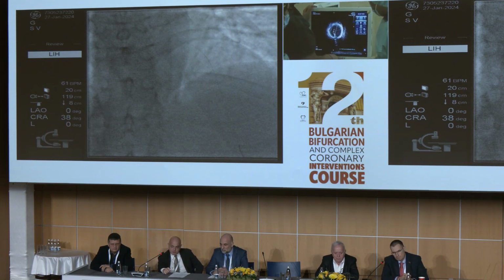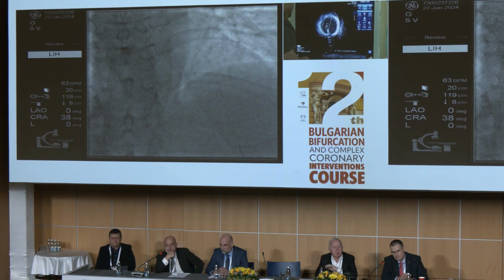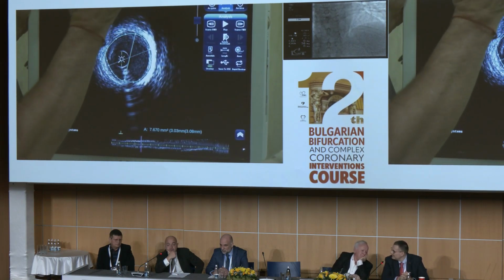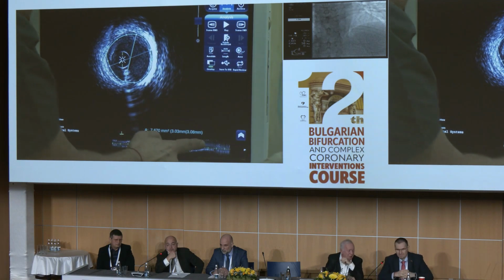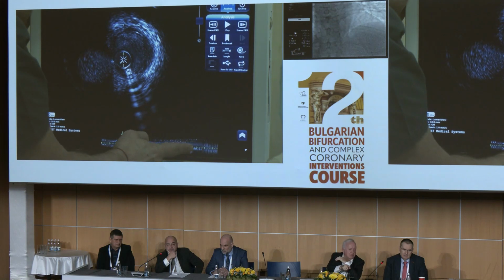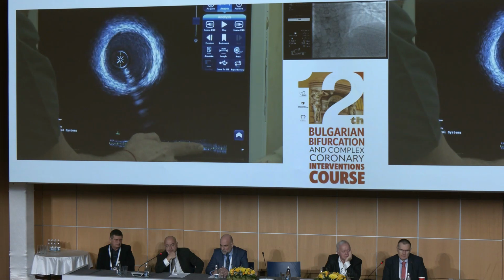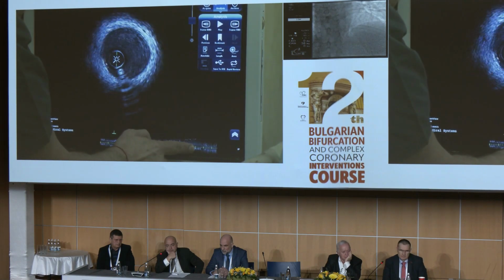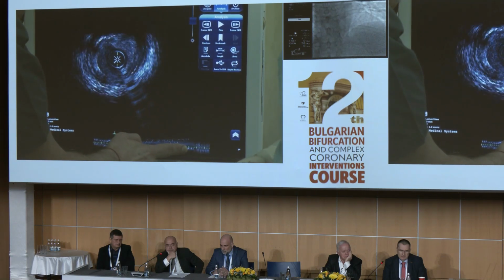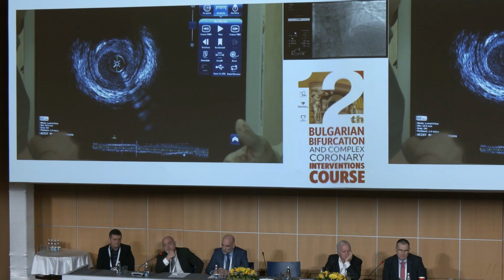So distally we measure 3.03 diameter in the distal lesion, so this is absolutely the reference vessel. Yeah. And let's see proximally, just for the pot and so on. Interesting, the highest plaque burden in IVUS is proximal to the bifurcation. So angiography is totally misleading regarding the distribution of the plaque. See, the highest plaque burden is proximal to the bifurcation.